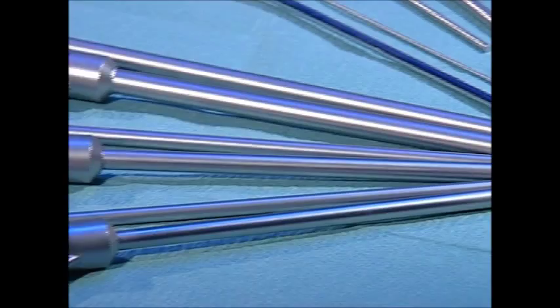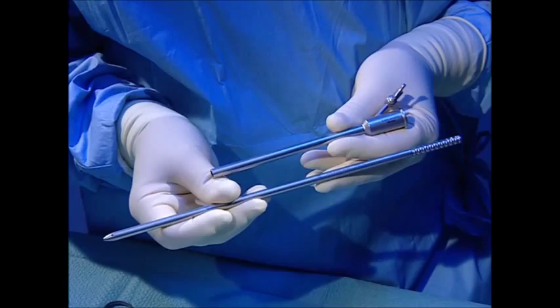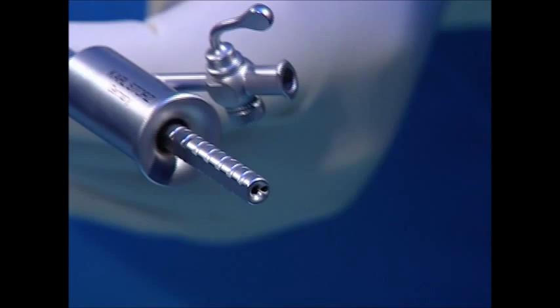The two larger dilators have an additional channel which allows secure placement in the renal collecting system after puncture. The correct position is demonstrated by the backflow of dyed contrast media. A second guide wire can be inserted through this working channel if necessary. The nephroscope's sheaths are available in three different sizes.